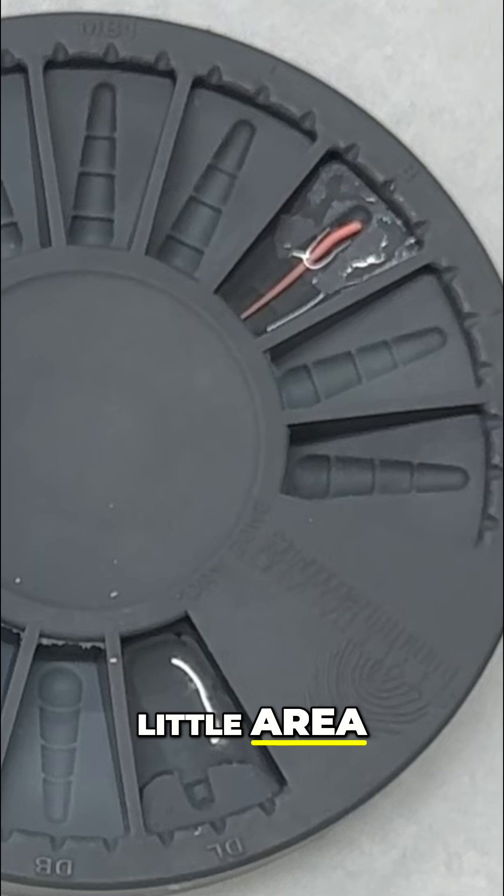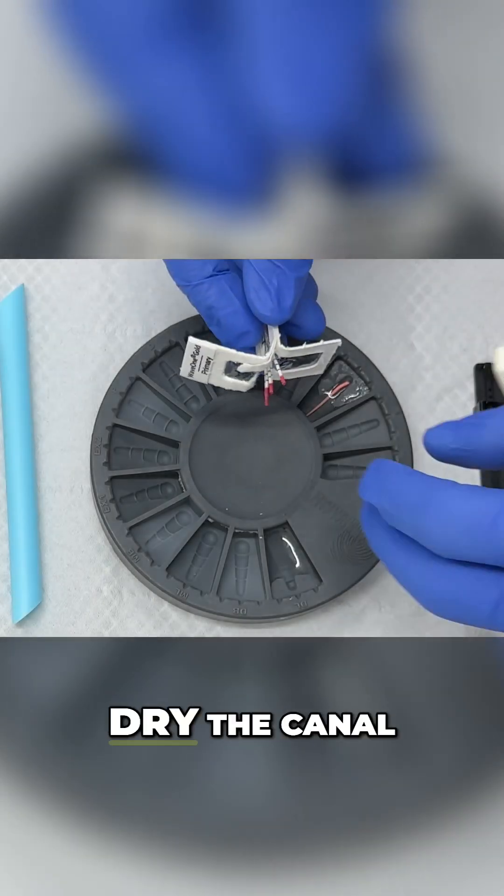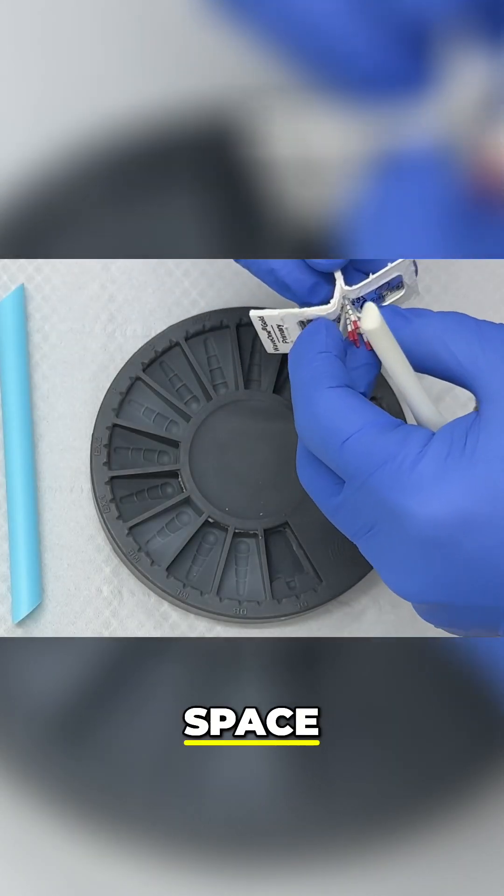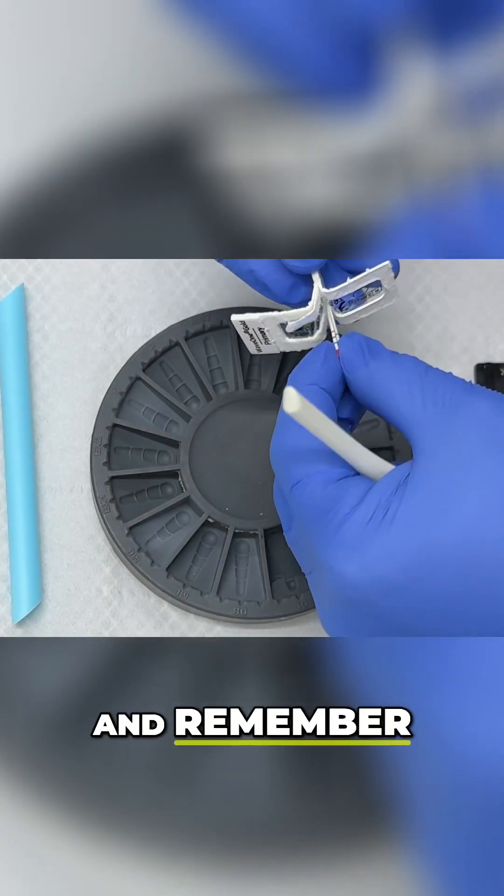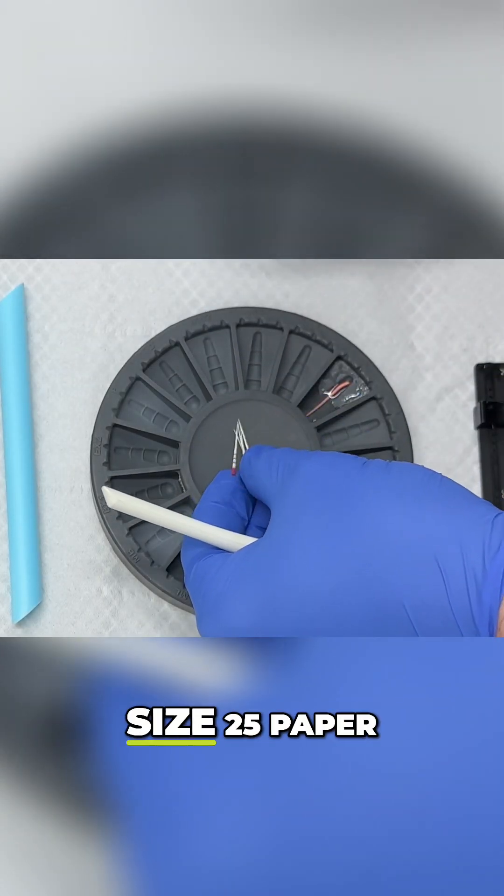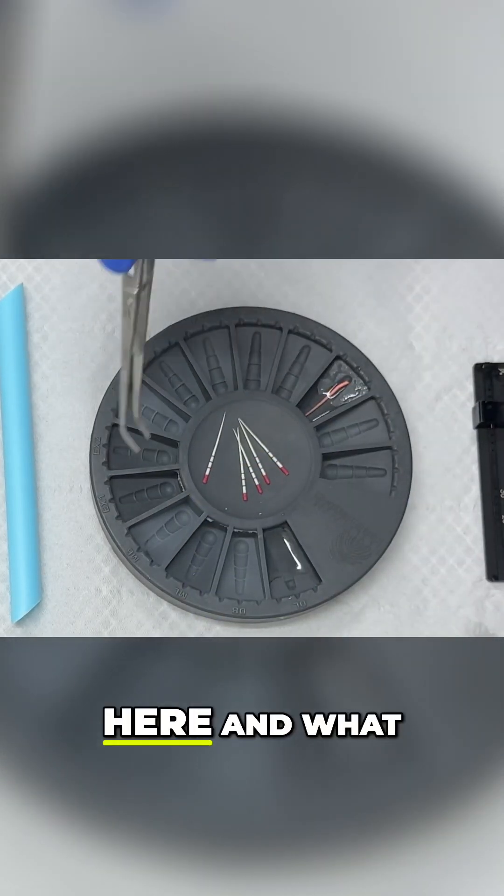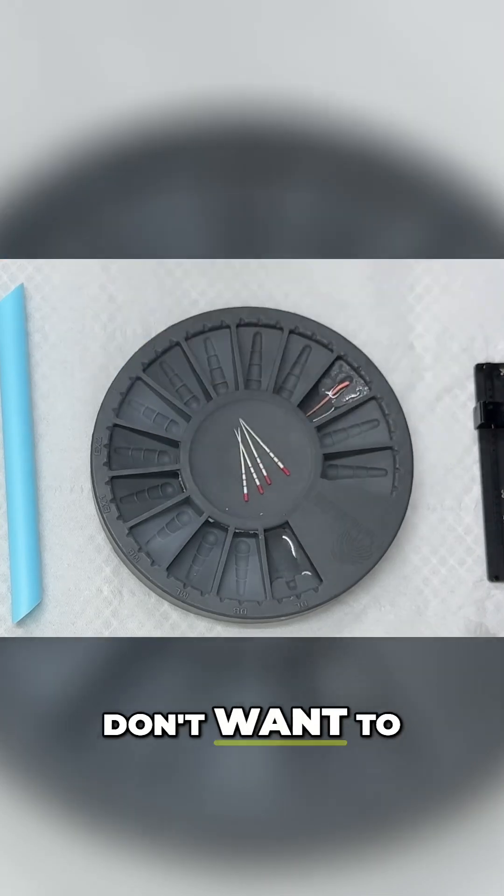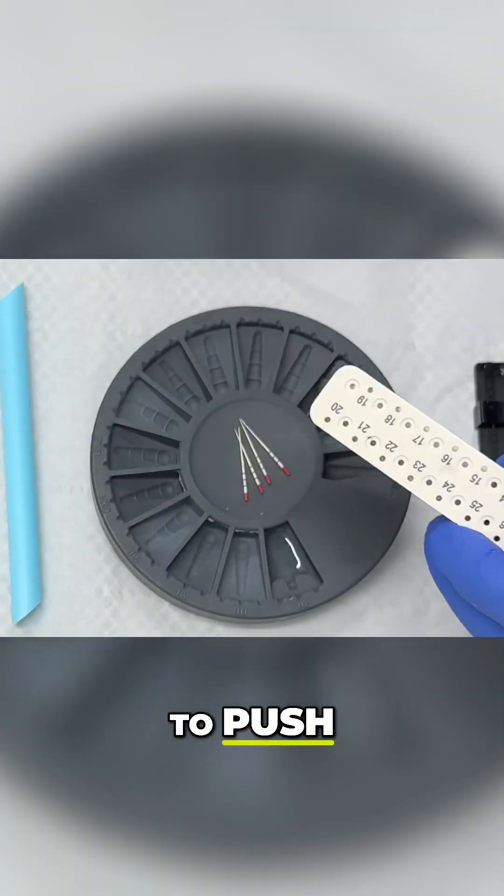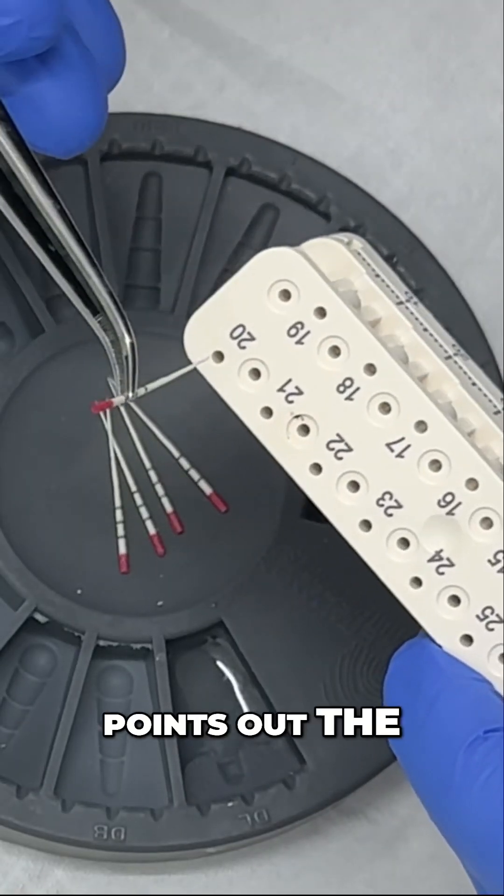Then we're going to dry the canal space. Remember, we're using size 25 paper points here, and what we don't want to do is push these paper points out the end.